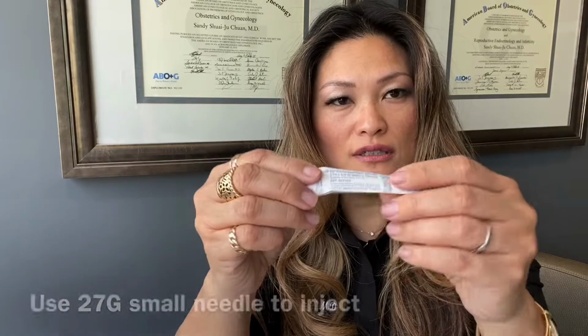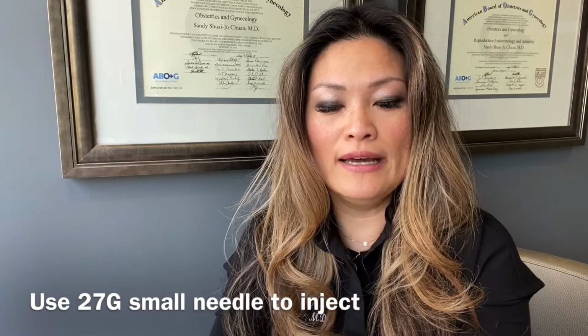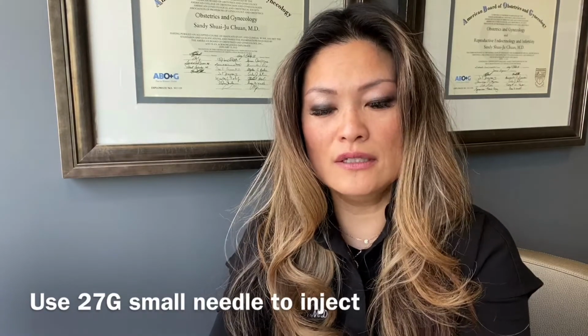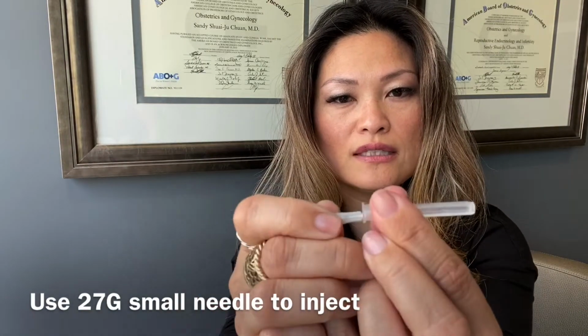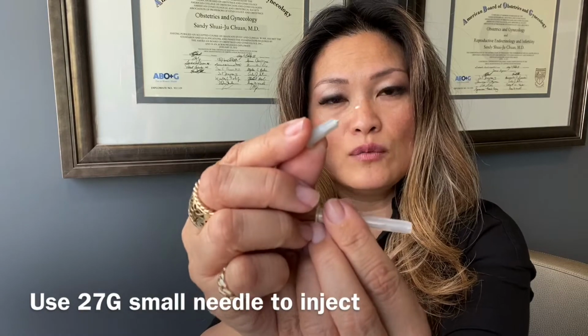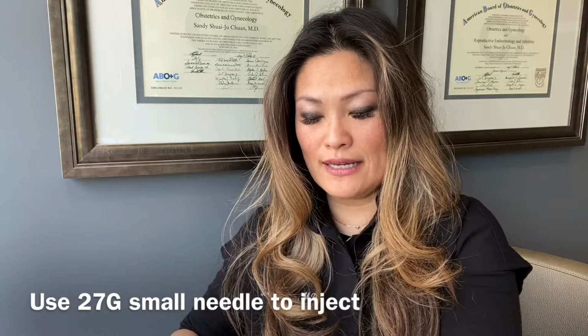You will have been given in these little packages smaller needles, and so if you look at the package, it will say 27G, which is 27 gauge, which means it's a small needle. I'm going to show it to you just so you can see how little that is. And I'm going to uncap it carefully and show you, see how little the needle is. So this will definitely be more comfortable to inject with, okay? So you'll want to make sure that that's ready as well. And obviously this is an open package because I'm demoing.